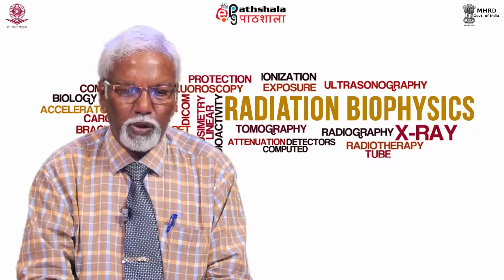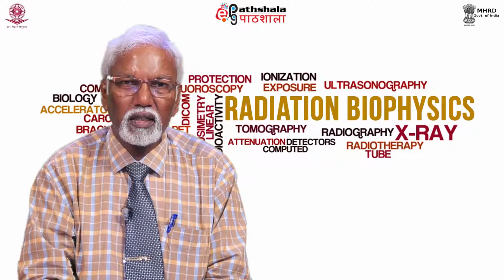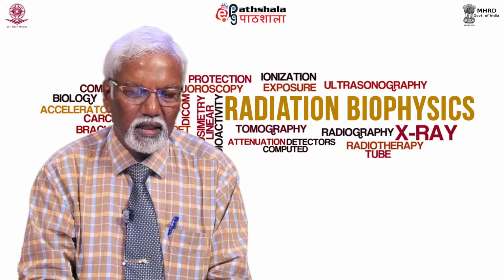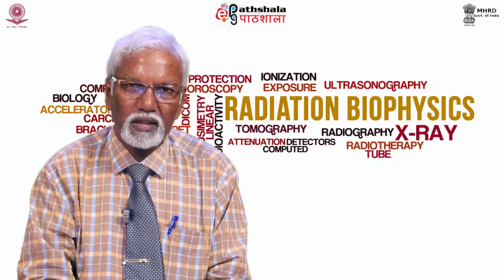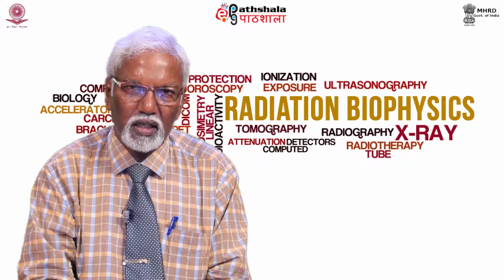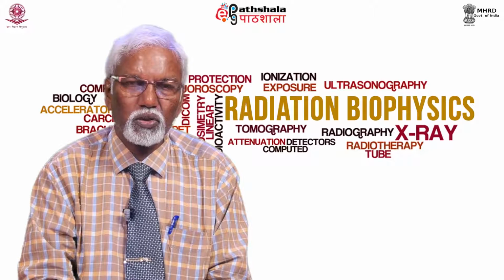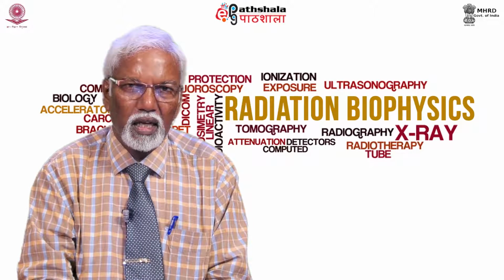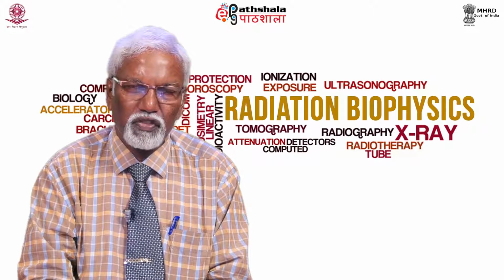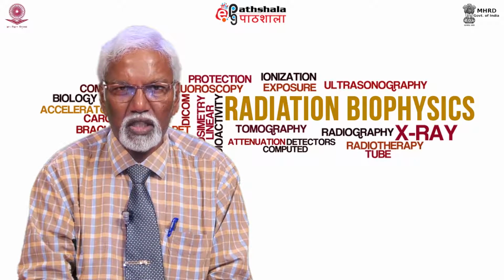So why do we need a computed tomography scanner? For imaging. Before the computed tomography scanner, we were using radiographic methods with X-rays. Radiography is a two-dimensional imaging, so it has the difficulty of superimposing the images and it cannot give three-dimensional information. But unfortunately, all our organs in the human body are three-dimensional in nature.